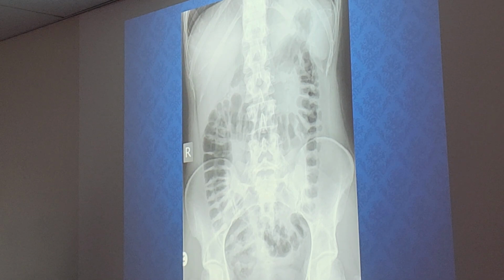All right, what projection is this? AP. AP, and we know that because we only do AP abdomens. Okay.